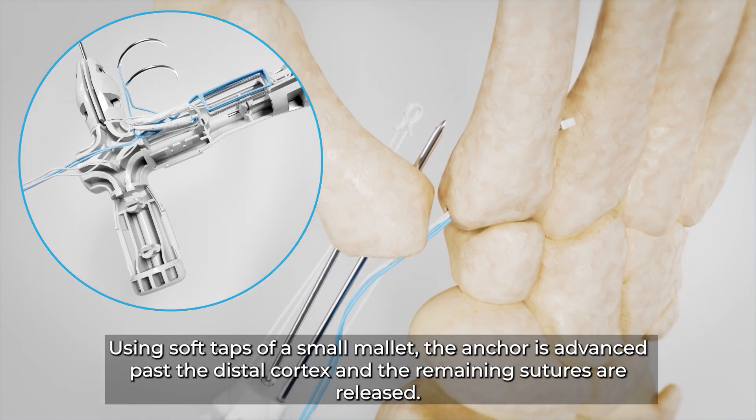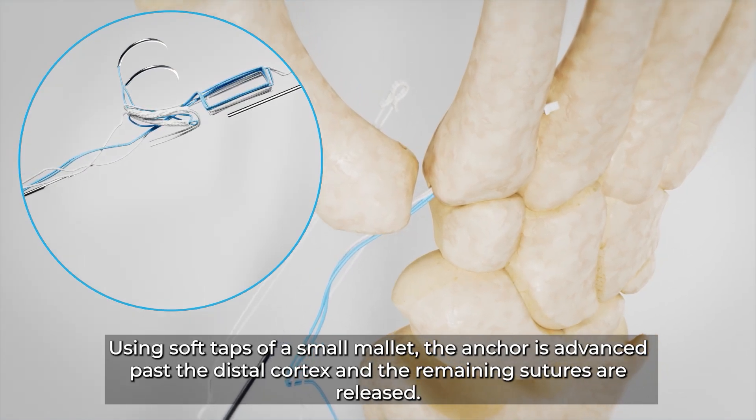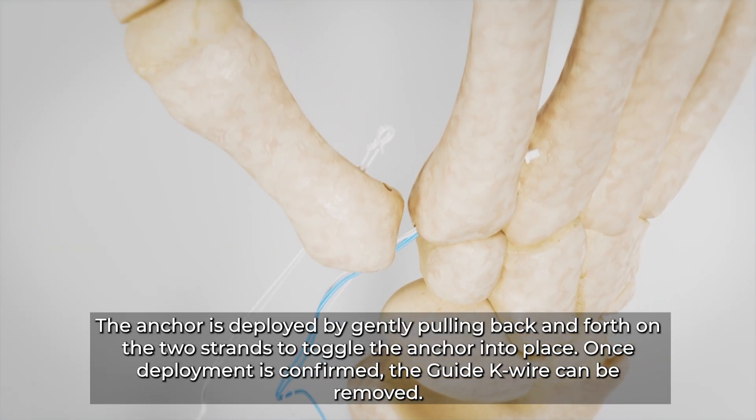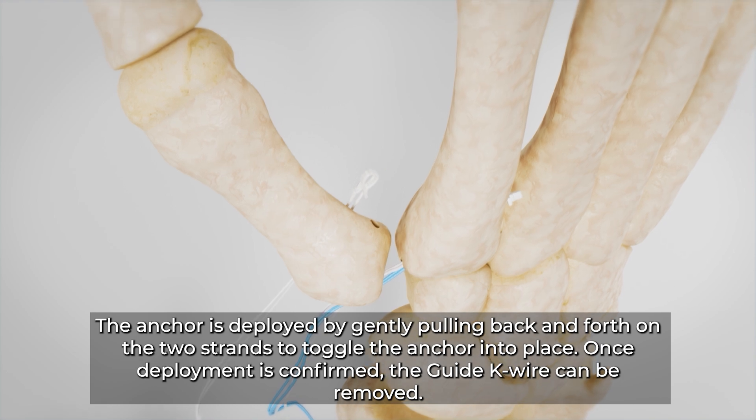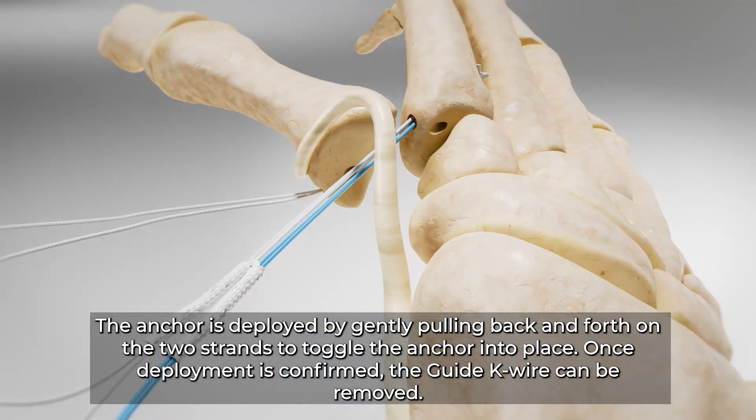Using soft taps of a small mallet, the anchor is advanced past the distal cortex and the remaining sutures are released. The anchor is deployed by gently pulling back and forth on the two strands to toggle the anchor into place. Once deployment is confirmed, the guide K wire can be removed.